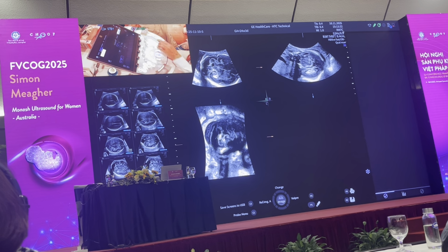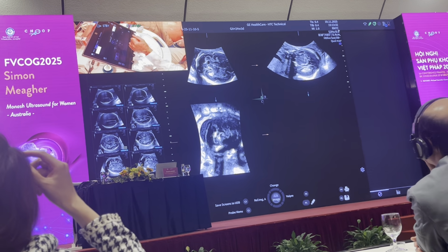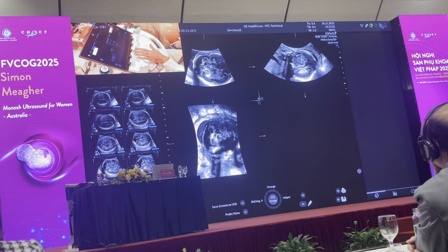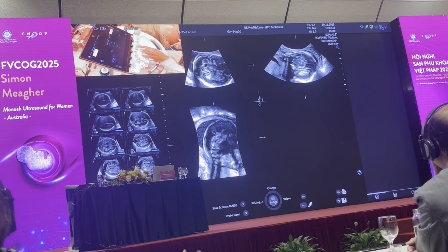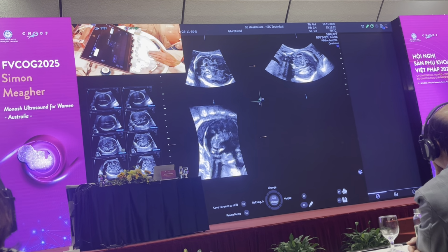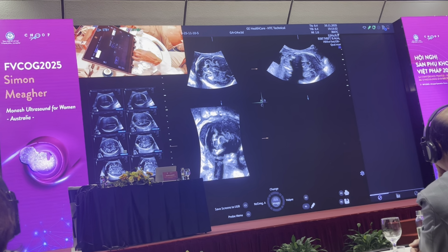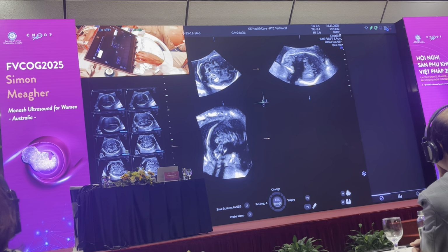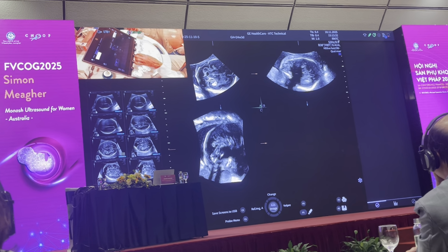And in terms of the multiplanar evaluation of the brain, there are a number of ways of doing it. The first way is called the Z-axis technique. You can see my hand. So this is the Z button. And I select the A plane, and I place the reference dot in the middle of the face. And then I hit the Z button, and then I rotate until the head is in a 3 o'clock to 9 o'clock position. And then I do the same on the next plane.